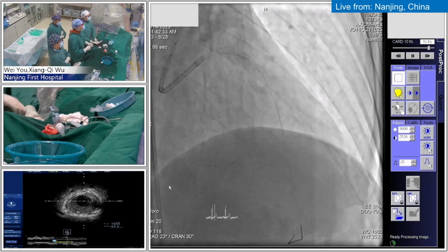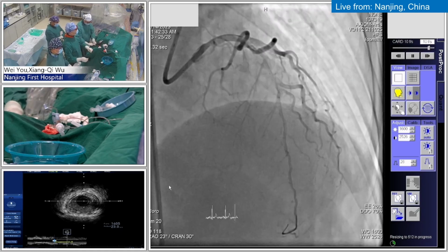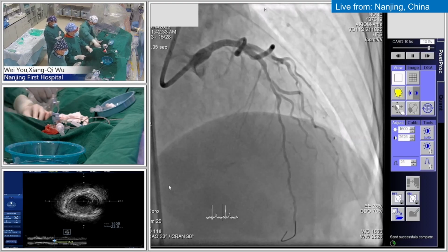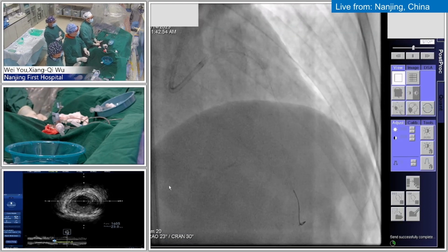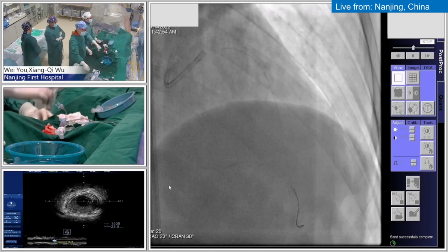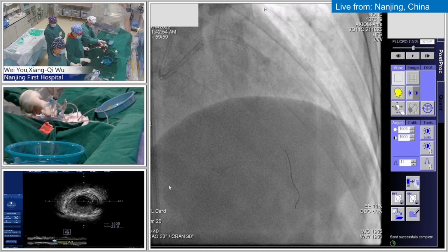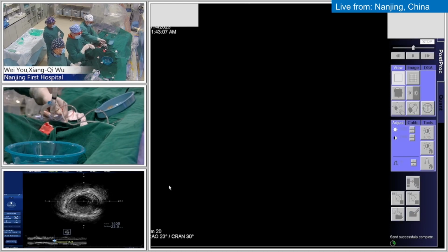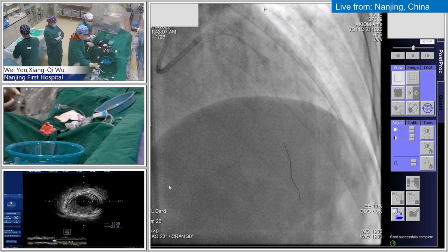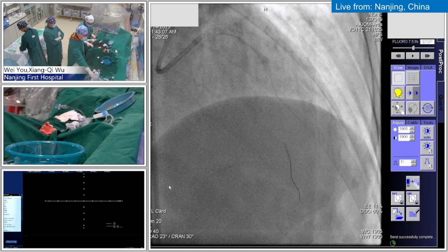Pretty early experience, but on average we are having 20 cases a day during these live transmissions. 51% of the cases are still coronary, with the largest two groups being left main bifurcation, trifurcations, and CTOs, and about 44% structural heart, with TAVR and mitral clip being the more common procedures.